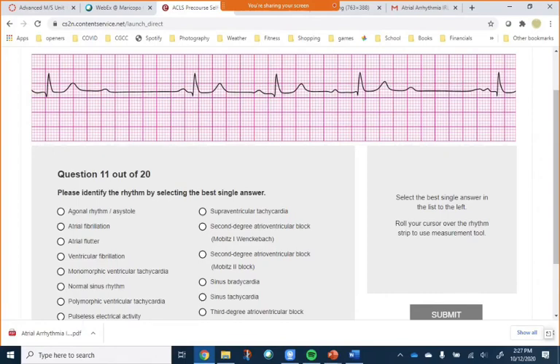So let's do a rate. 1, 2, 3, 4, 5. Oh, I know where we're throwing this one. It's going in the Brady. So look, you guys are already doing Mobitz. You're heading in there. So what we need to do is, one, I'm looking at this QRS to see, is it normal or narrow? And it really does. It is only 2 boxes, so it still fits within normal narrow, even though it looked a little wide to me. Let's do our PR intervals.